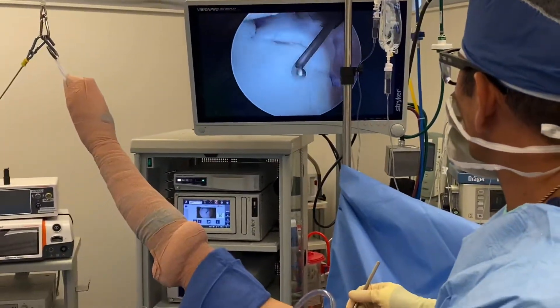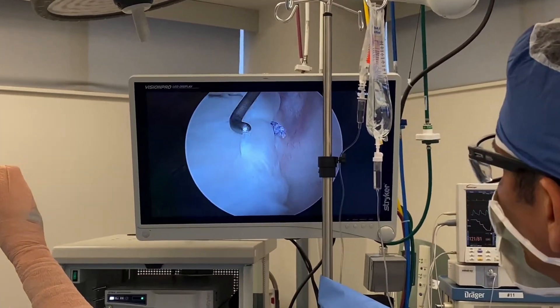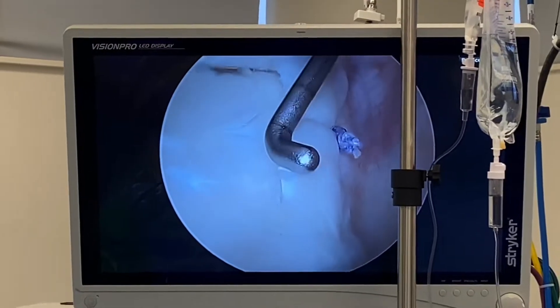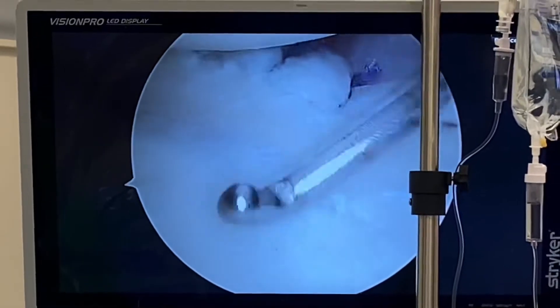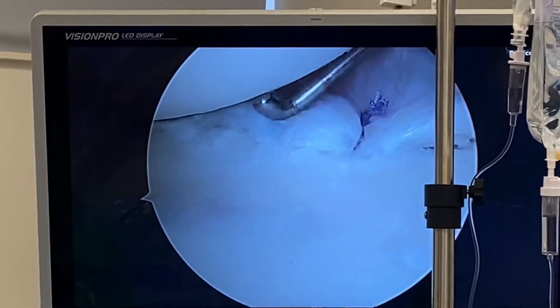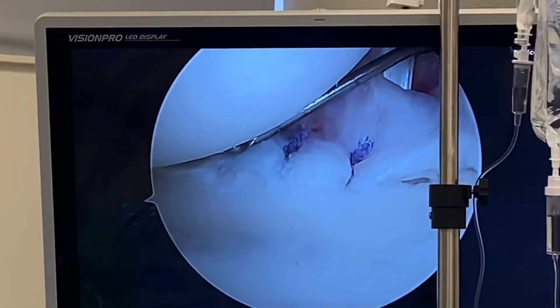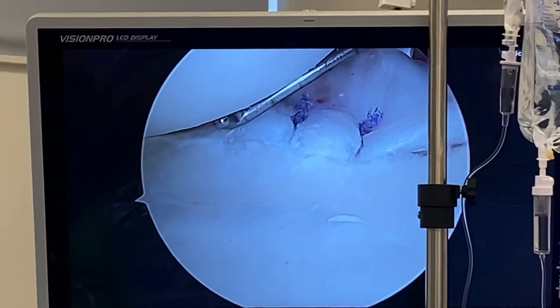I think part of that catching and locking came from the labrum. What I'm going to do is smooth this area out — just feather the edges so that nothing else catches — and remove anything that could be catching, like a little bit of frayed tissue that I'll smooth out. I tightened up the patient a little bit because it looked like they had a little bit of instability.